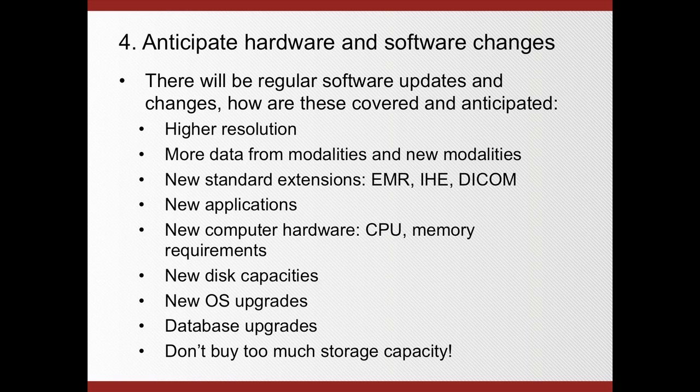Hardware changes will definitely take place as well. CPU potentially, but definitely memory requirements. You might need to upgrade by another 2 gigabytes to facilitate even larger data sets and even higher resolutions. New disk capacities and operating system upgrades, as well as database upgrades.